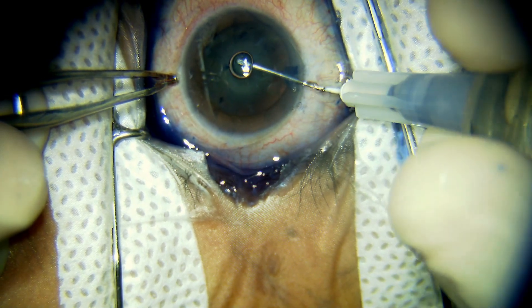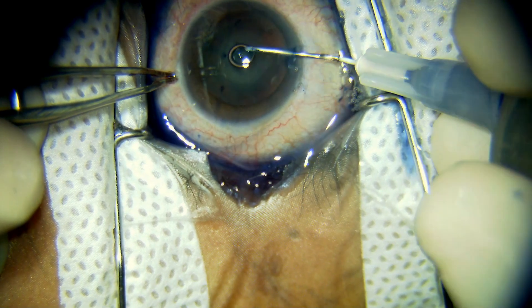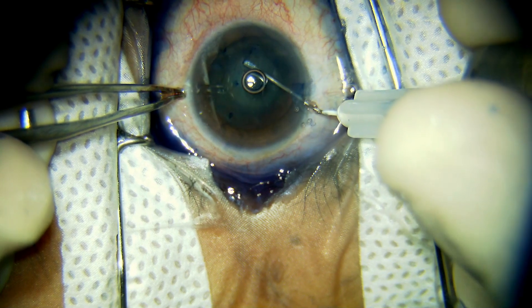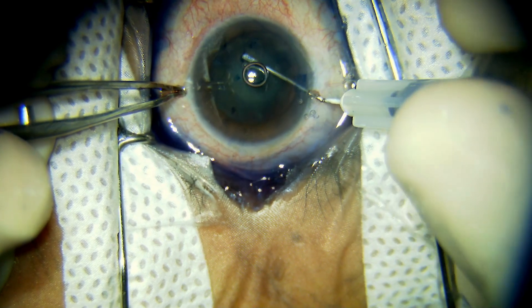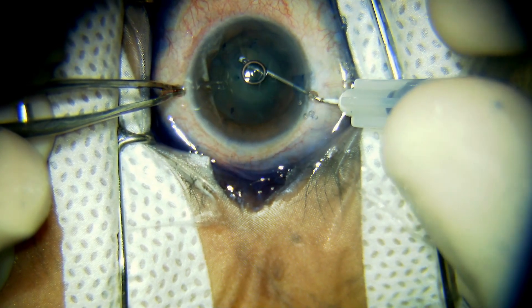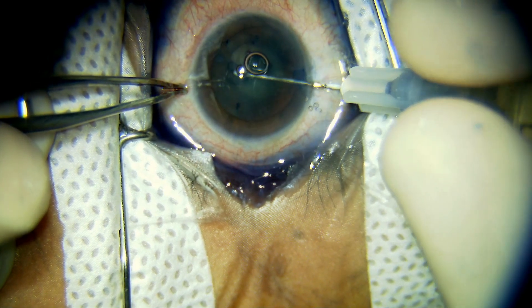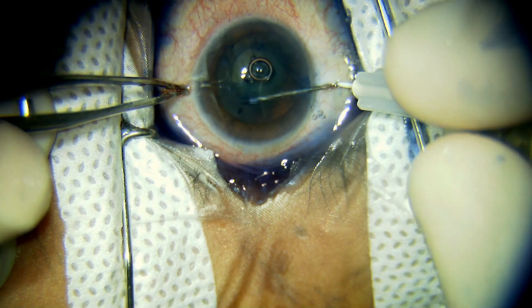This is near-live surgery with unedited video demonstrating management of a PC tear with more than one half of the nucleus still inside the bag.